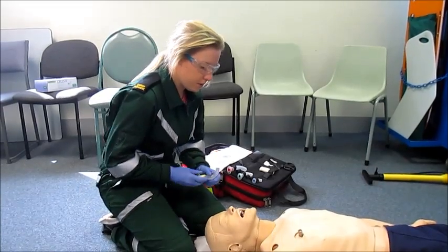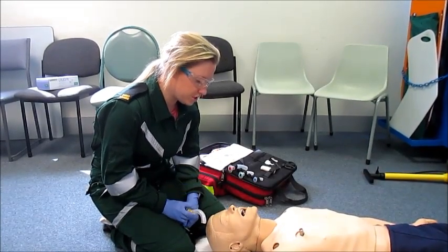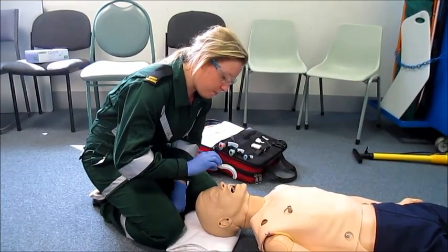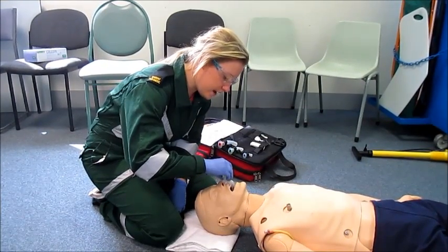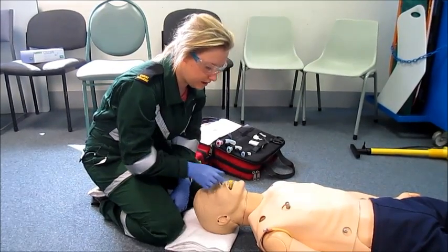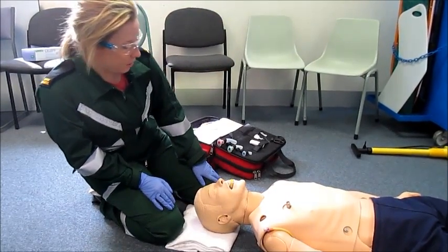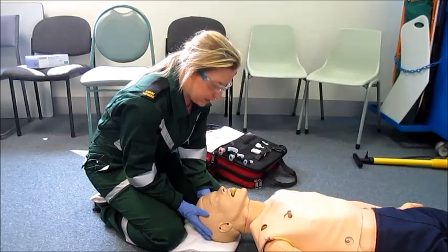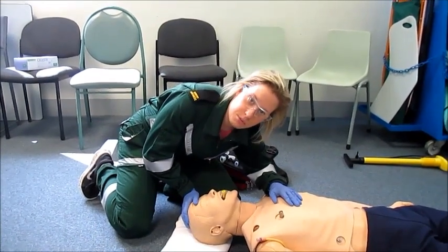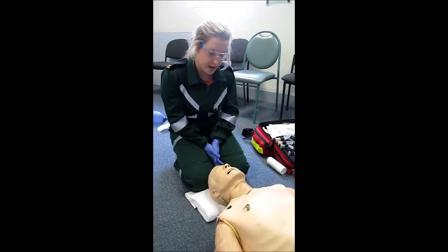To insert, we can either lubricate it using the patient's saliva or water. Putting the curve upwards, I'm going to insert it halfway, and once halfway I'm going to rotate it 180 degrees and bring it down to the lips. I'm then going to check for a gag reflex and also look, listen, and feel for breathing.